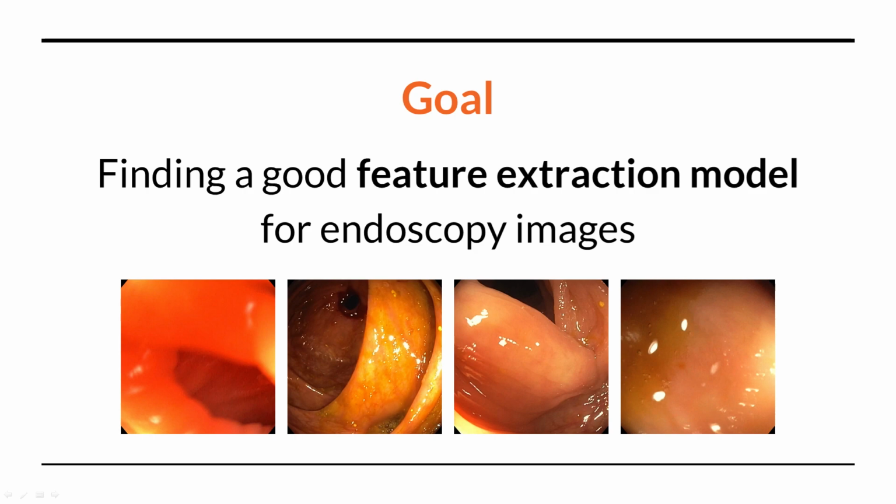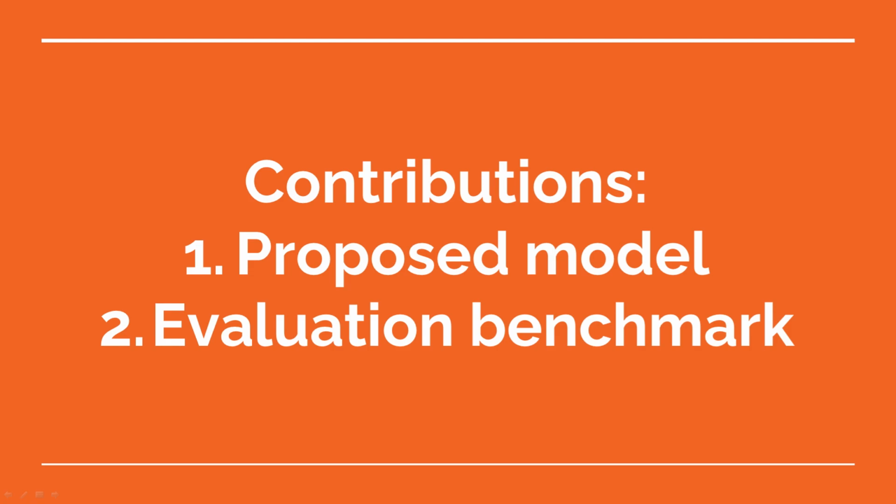The goal is to find a good feature extraction model that works well in endoscopy images. This problem is really hard because of frequent occlusions, blur, liquids, and specular reflections that hinder visibility. The main contributions of the paper are both the proposed model for this task and the evaluation benchmark we created to validate this and other models.